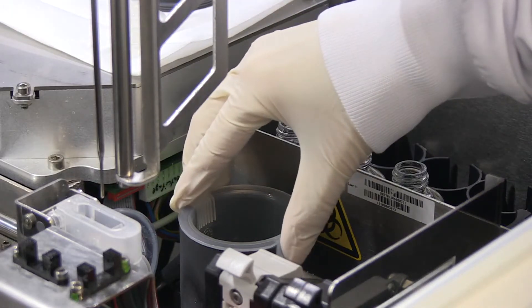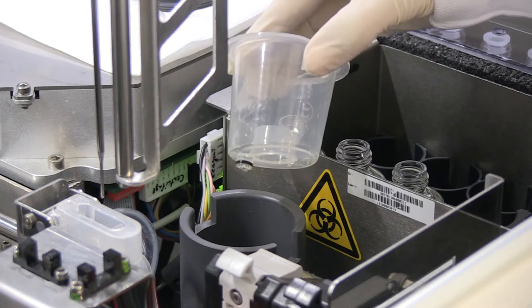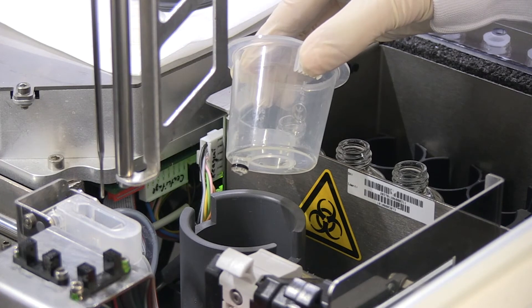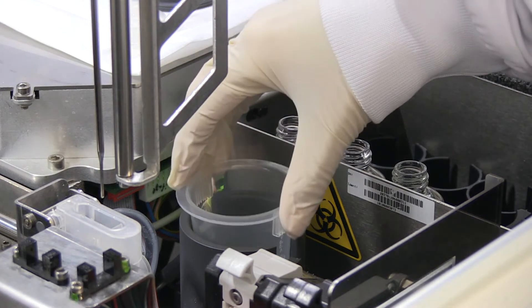Inspect the splash bowl visually. Make sure the suspension cup is empty; replace it if it is dirty or damaged. Caution: make sure that the splash bowl and the suspension cup are inserted properly, otherwise a malfunction may occur.